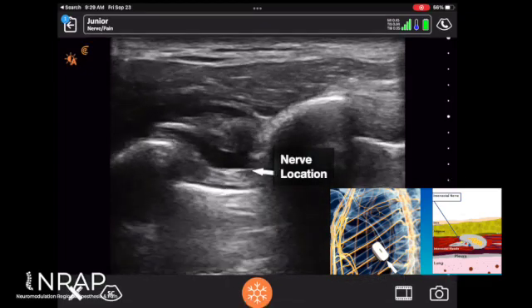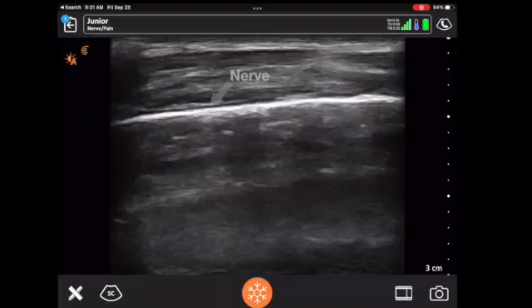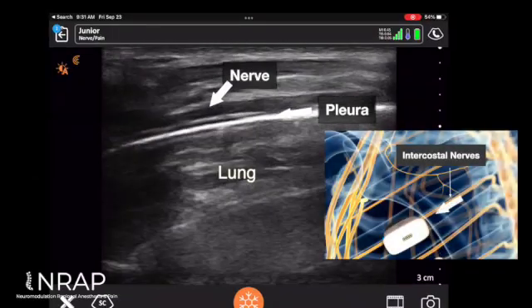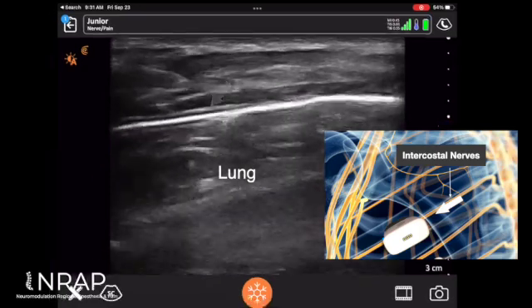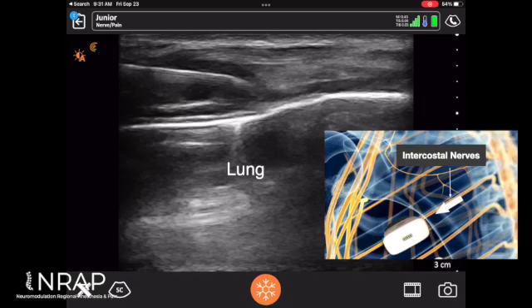Mind where the needle is inserted. You can do this shot with a longitudinal or cross-sectional view. Here's the longitudinal view, and the lung is even more superficial in this view — almost 0.8 to 1 centimeter depth.